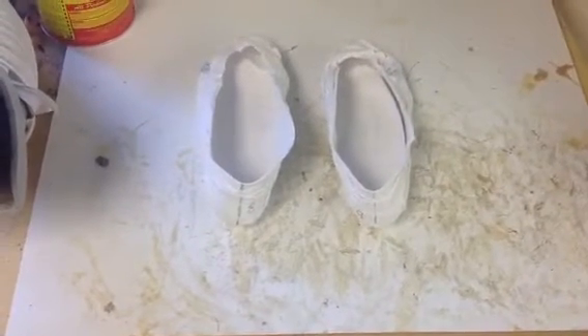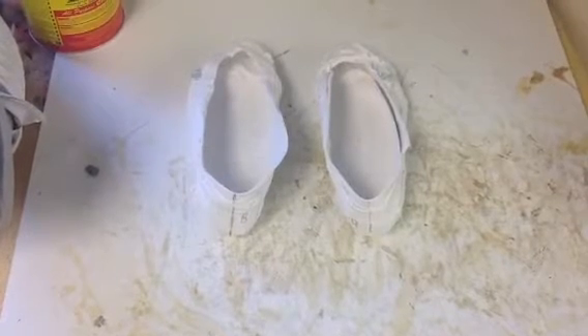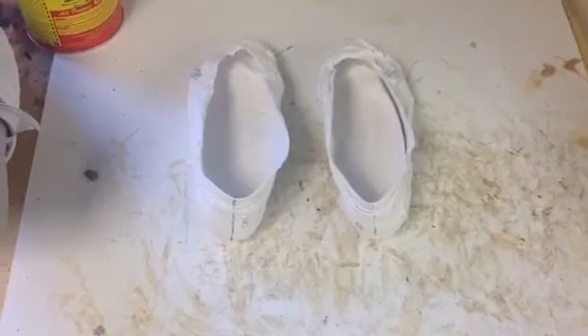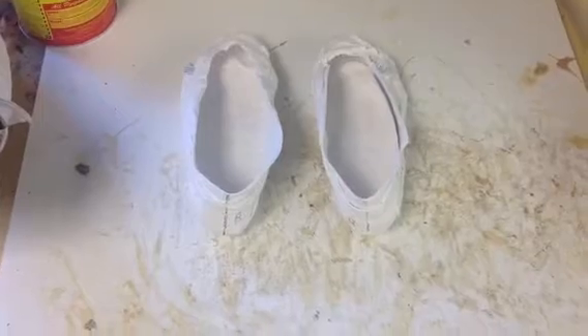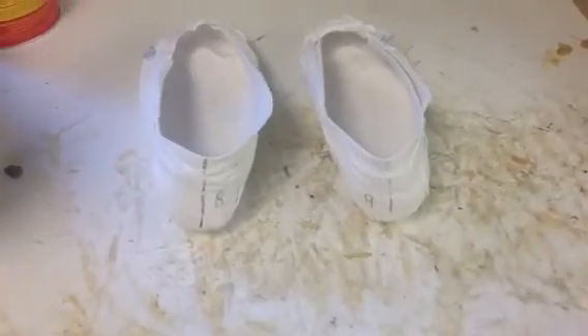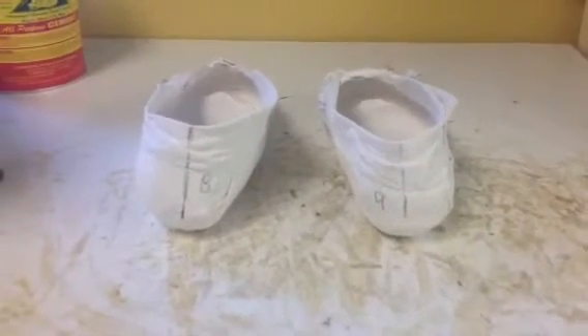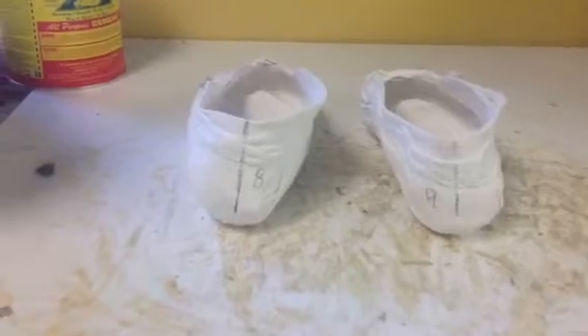This means that when you take a step, the foot pronates inward to bring the first metatarsal down to the ground. Now this is a cast of a foot, or a pair of feet, that show this forefoot varus.